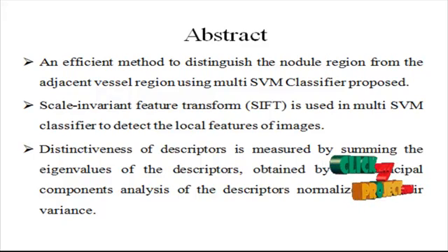Computer-aided diagnosis of lung CT data is a new quantitative analysis technique to distinguish malignant nodules from benign ones. Nodule growth rate is the key indicator to discriminate between benign and malignant nodules. Accurate nodule segmentation is essential for calculating the nodule growth rate. However, it is difficult to segment a juxta-vascular nodule. This is due to the similar gray levels in the nodule and attached blood vessels.